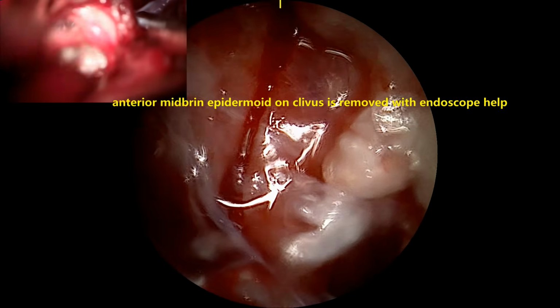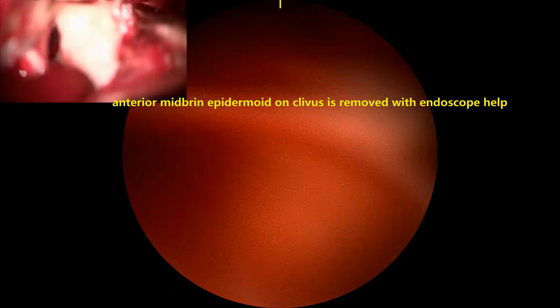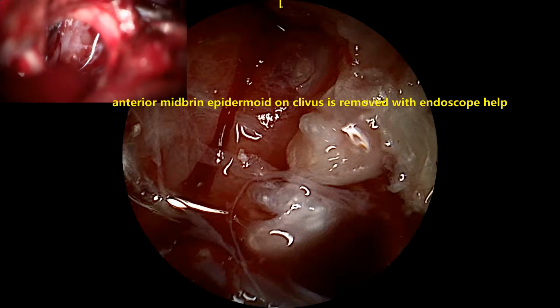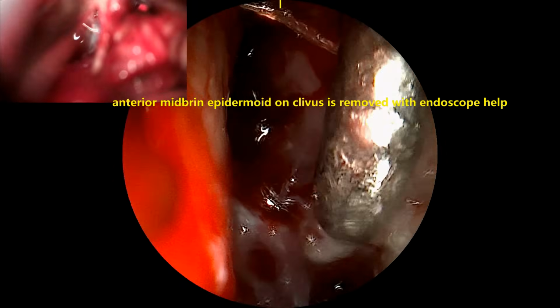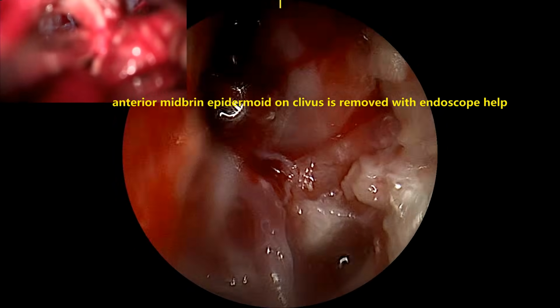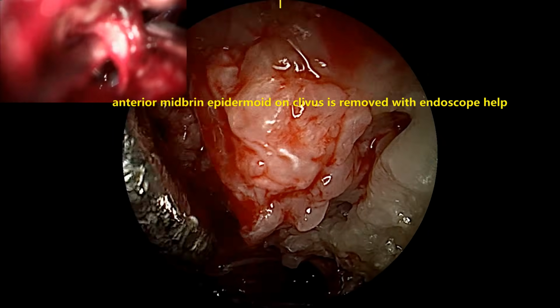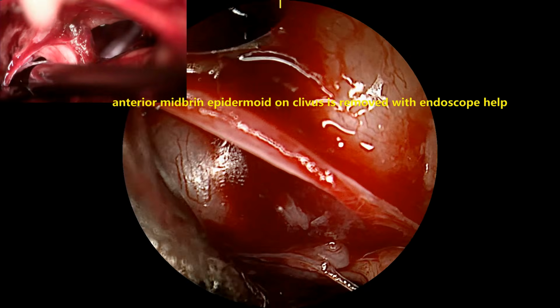Now with endoscope assistance, with the slow dissection, suction and blunt dissection, the lesion is being separated from the anterior part of the midbrain, superior part of the pons, and anterior midbrain around the 3rd and 4th cranial nerves and the basilar artery. That is the posterior cerebral artery, posterior communicating artery, and anterior part of the midbrain at the level of the posterior clinoids, which is going superiorly and medially into the temporal region. That is taken out completely now.